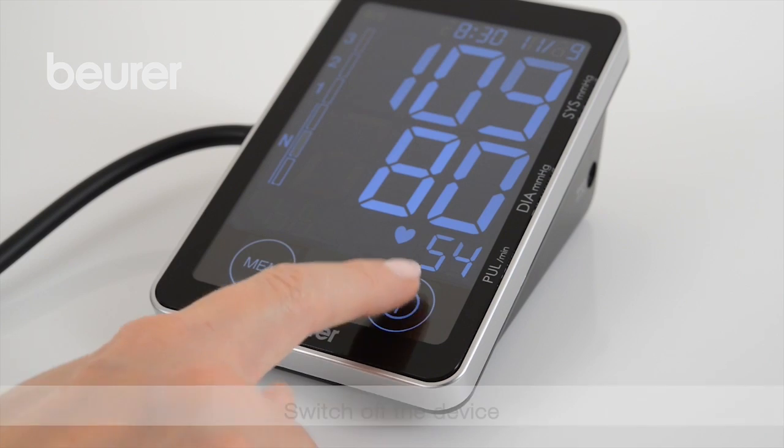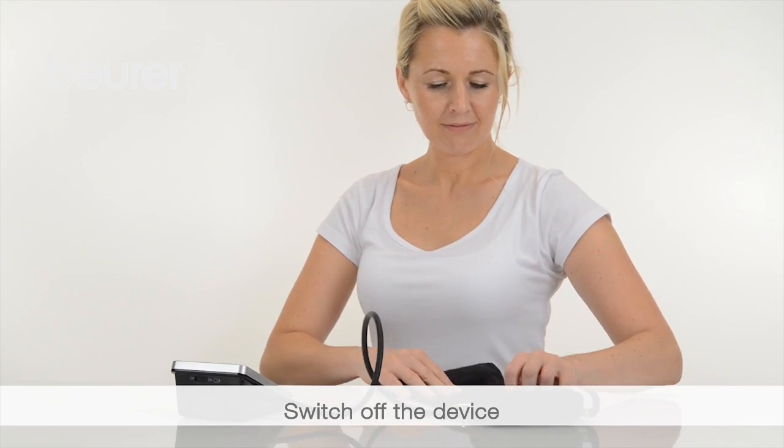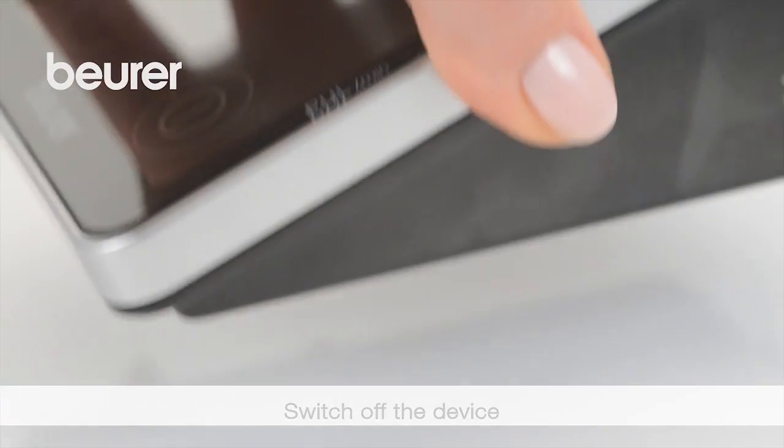To switch the device off, press the start stop button or set the touch screen activation switch to off. After one minute, the device switches off automatically.